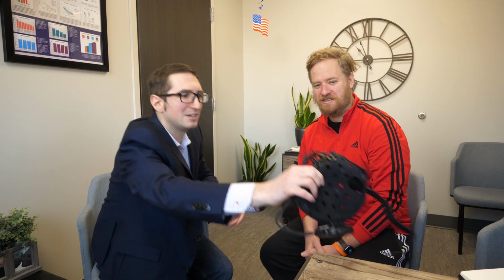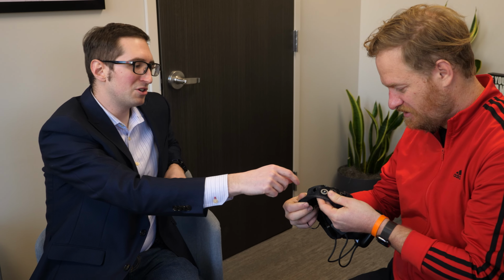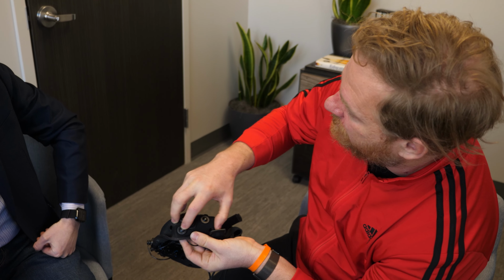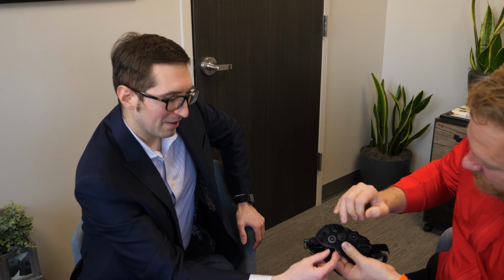Here's a cap right here. Oh, this looks awesome. Do you want to go ahead and hold it? So we have a bunch of sources, so emitters of light, and then detectors. Oh, and they're not at the same place. So this is like an infrared LED. Yep. And then an infrared detector. Yes. So they're filtering out visible light and only picking up infrared. Exactly. So you can wear them in the light and not just the dark. Exactly. You want to still control for those things a little bit.